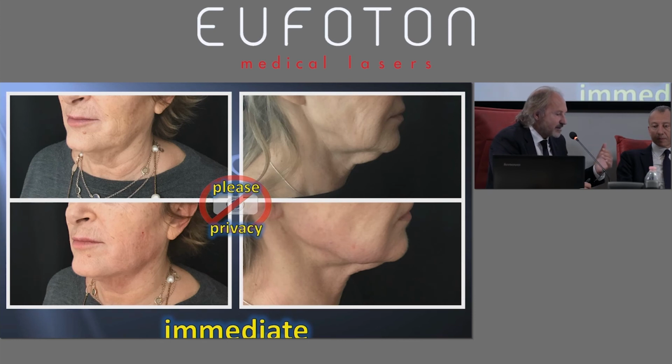manual skills and setting can make the difference. One passage, medial superficial, but superficial on the fat, and then an additional passage, a second passage, with reduced, low fluences, trying to be very close to the dermis, scratching the dermis from the inside. That's a good approach. That's a good way to go.